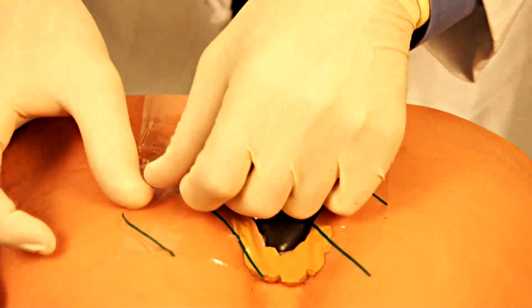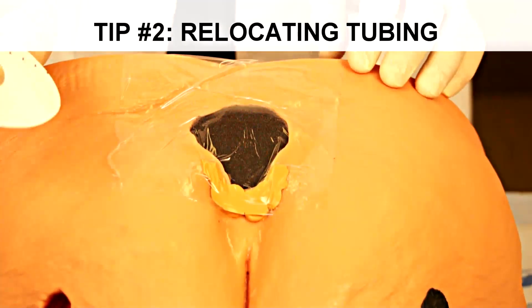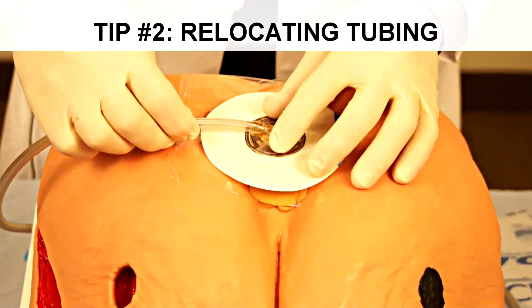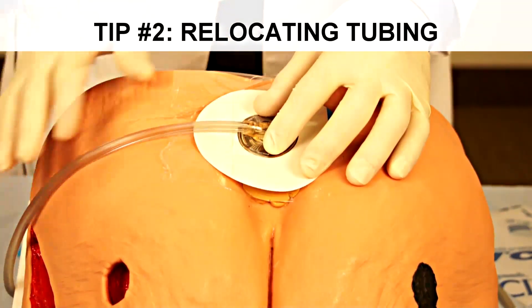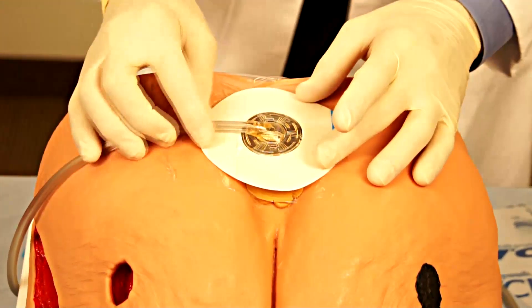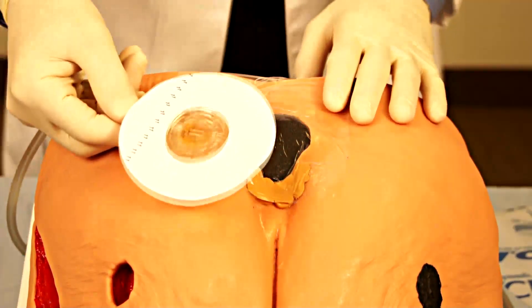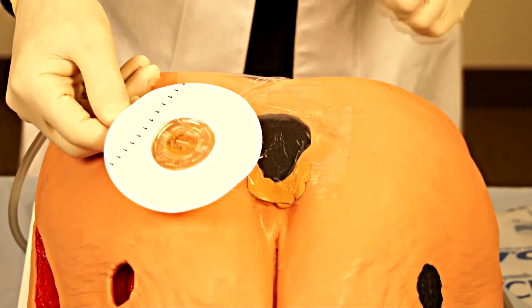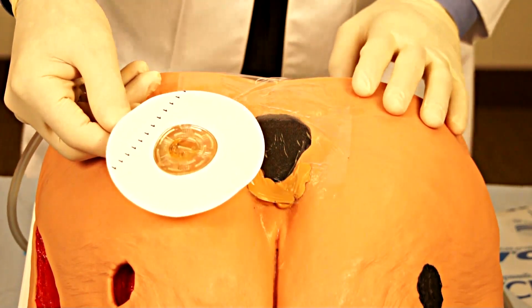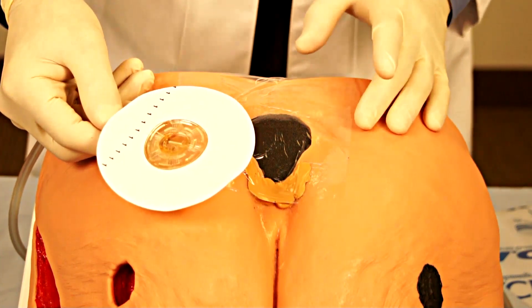It is not uncommon when applying your suction tubing that the tubing may run across a portion of the body where you would not like the patient to be laying on tubing. The suction device can be located elsewhere off a site of support, and to do that we would construct a bridge.